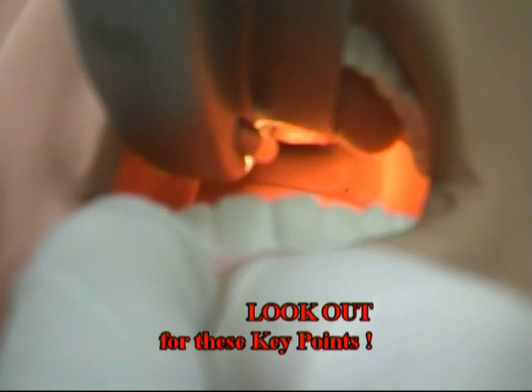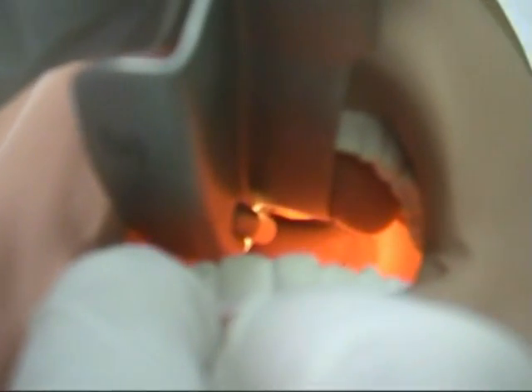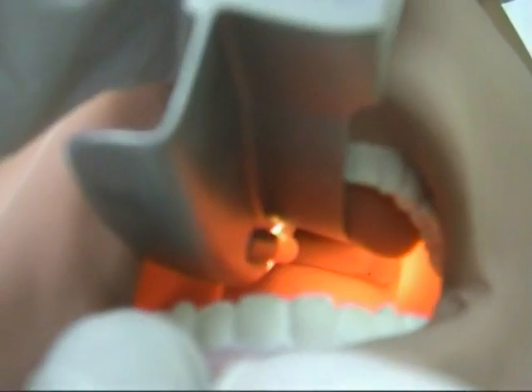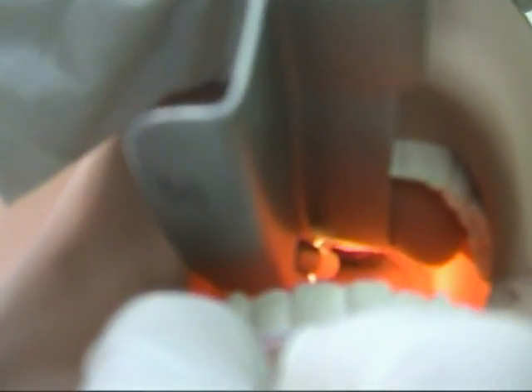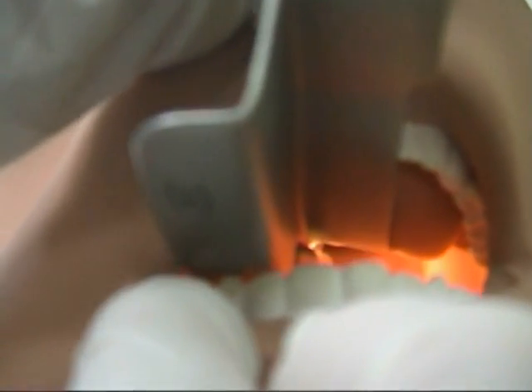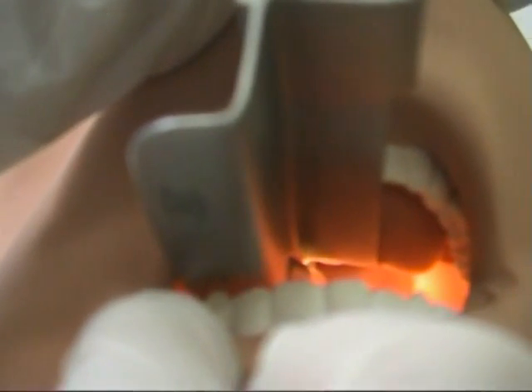Put the tip of the blade into the vallecula, and when the tip of the blade is correctly positioned, lift the laryngoscope upwards and forwards at a 45-degree angle, directing the force of your lift along the axis of the laryngoscope handle.